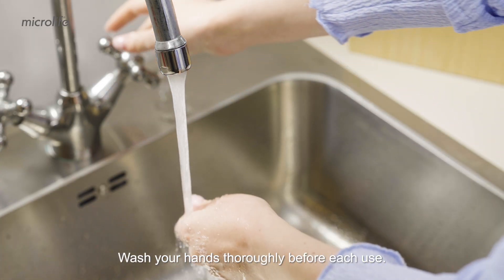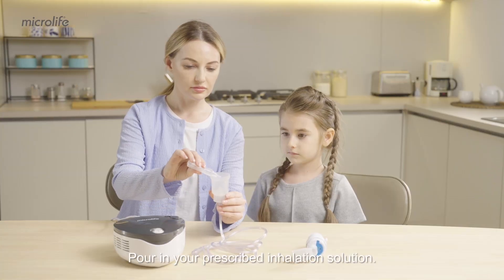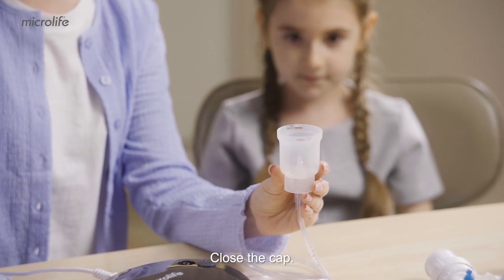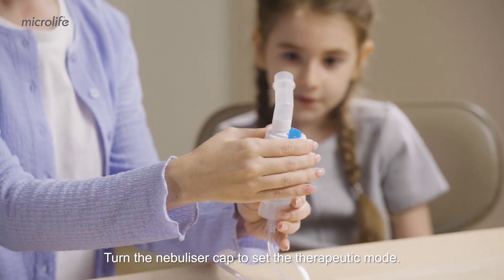Wash your hands thoroughly before each use and pour in your prescribed inhalation solution. Do not exceed the maximum level. Close the cap.